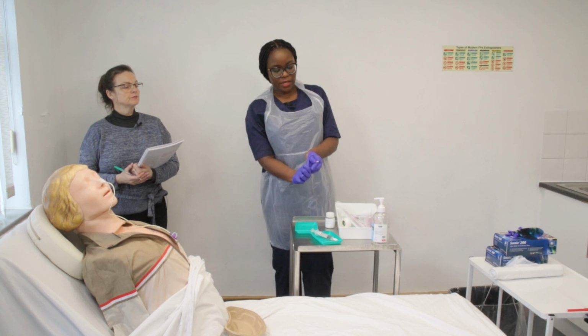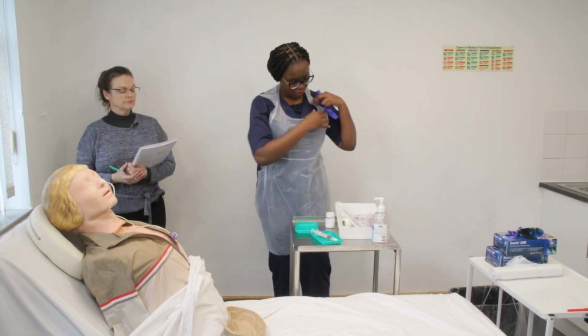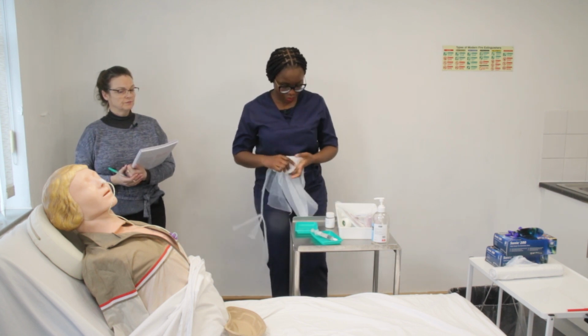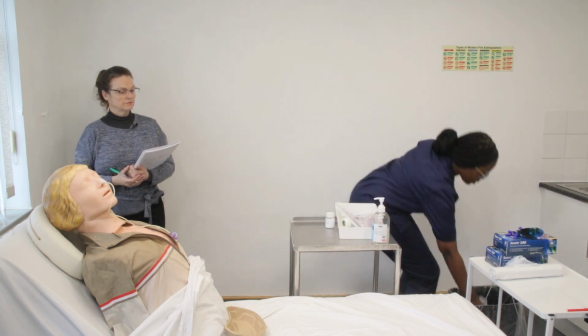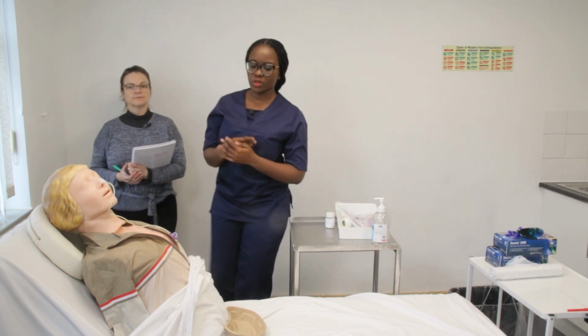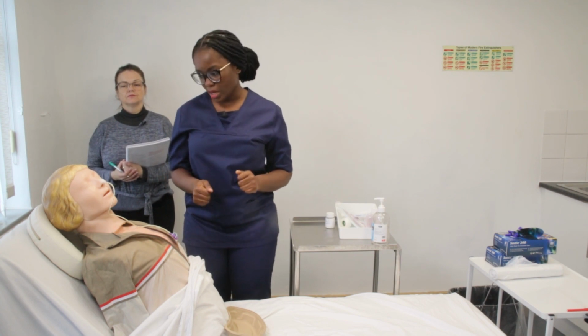I'm going to discard the pH strip with the glove, apron, and everything else into the clinical waste. Gel my hands. So, I'm done now, and I've just checked your pH, okay?